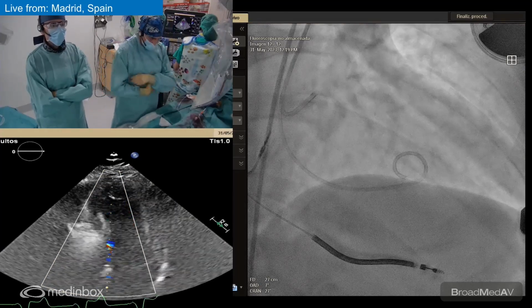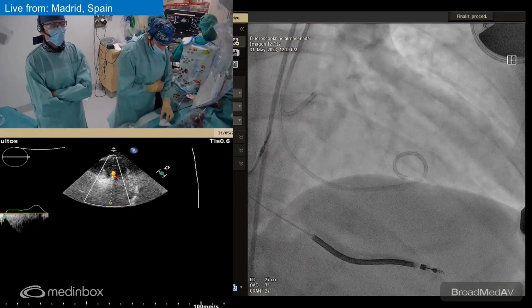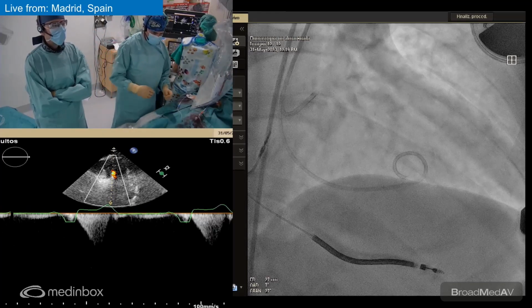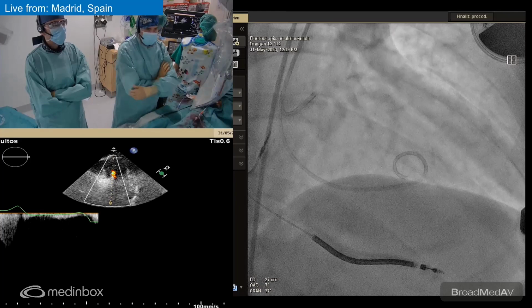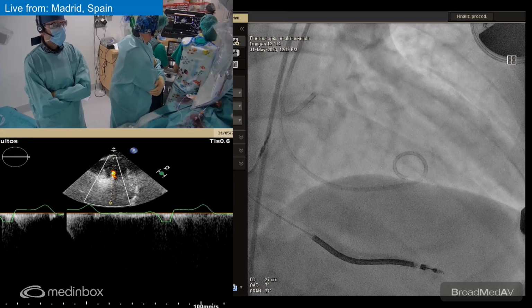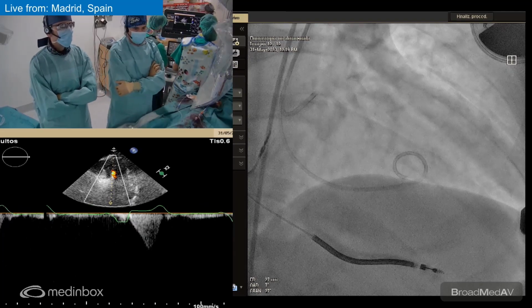Yeah, today Santi crossed the septal in, I don't know, 10 seconds, but the other day we struggled for 20 minutes to engage the correct septal. But once you have the septal, the balloon almost always goes because these are usually normal coronary arteries.